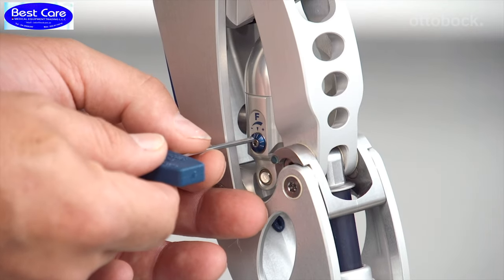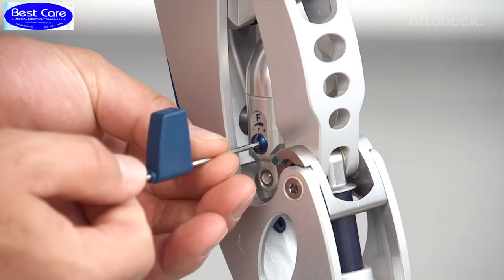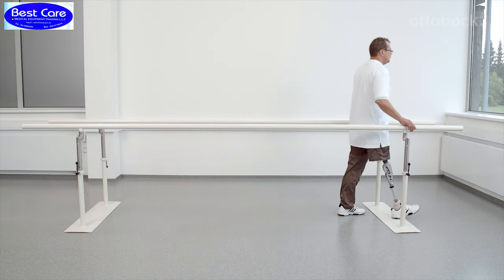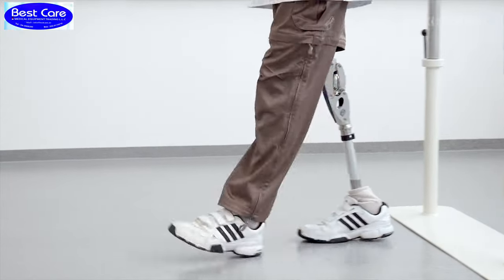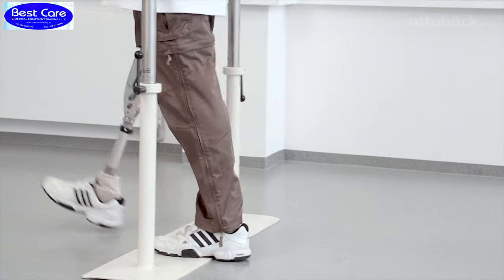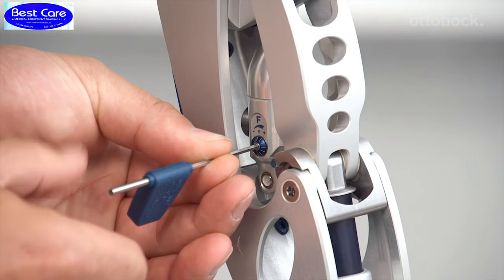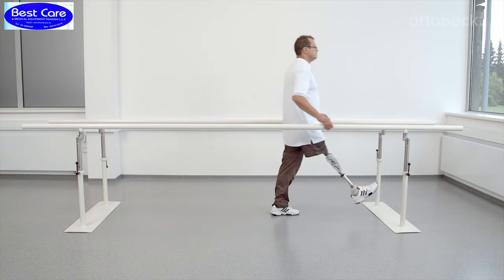The following video sequence will demonstrate how the knee joint reacts at the extreme settings of the swing phase damping. First, the knee joint is shown with the flexion damping set at the minimum. At higher walking speeds, the user has to wait too long for the prosthesis to reach full extension at heel strike. Next, the flexion damping is shown at the maximum. As shown in this sequence, the knee flexion is too little for the user.